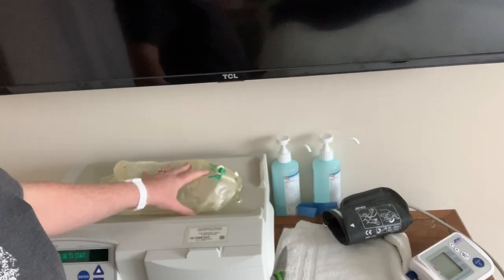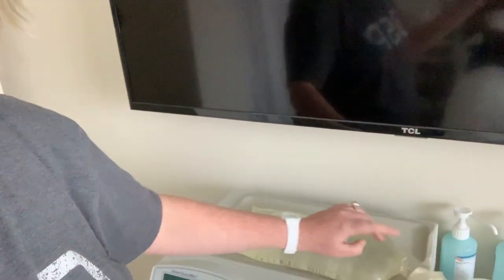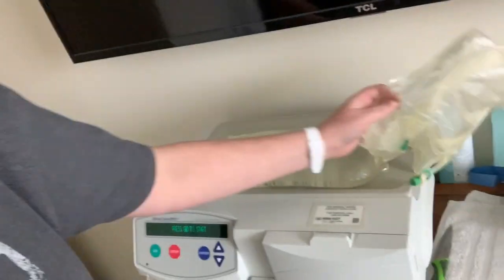What's up! Today I have been requested by a few people to show how I actually hook up to my dialysis. So right now I have a manual bag that I need to drain and I'm going to fill this into my body, so I thought I would just show you how it's done.